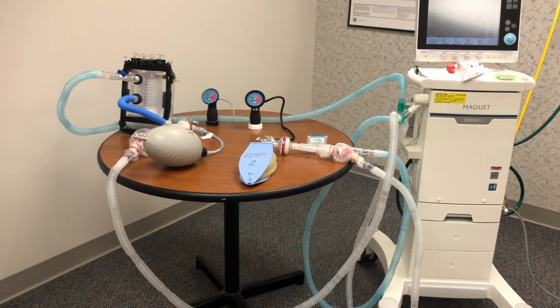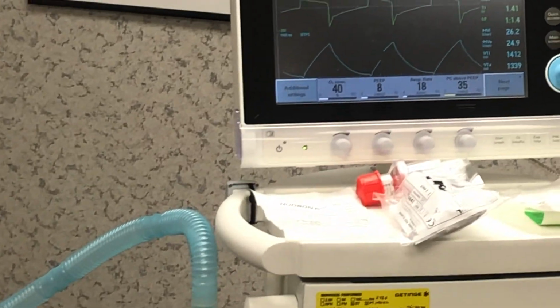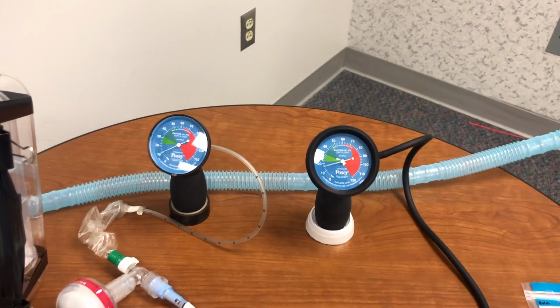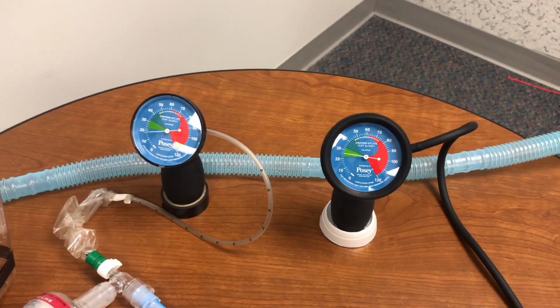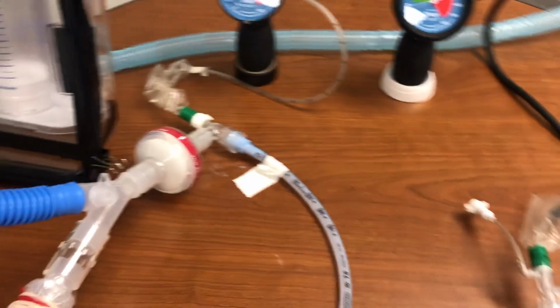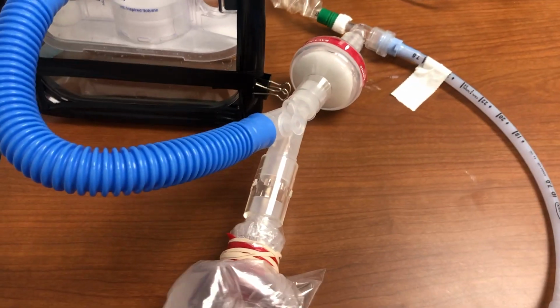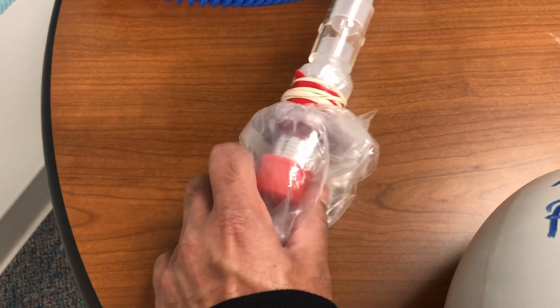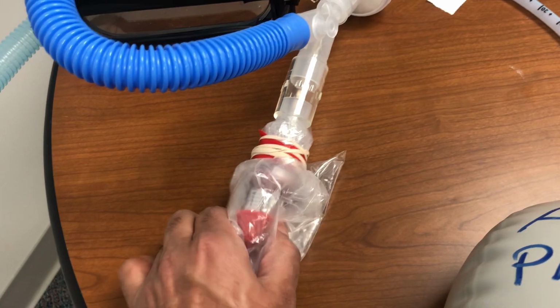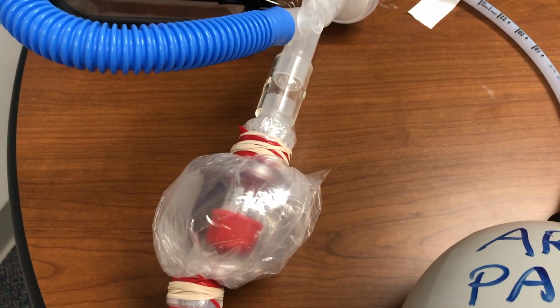Now the other important thing about this is, let's say that a patient requires higher PEEP. Now we have a PEEP of 8 on the ventilator, and both patients are getting approximately a PEEP of 8, right? And you can see it here, it's very accurate actually. If you measure that, it's coming to around 8. So what I'm going to do is change this patient's PEEP with the PEEP valve. This is again a little cumbersome, to 10 or 12. I'll have to stop the video for a second and change it.